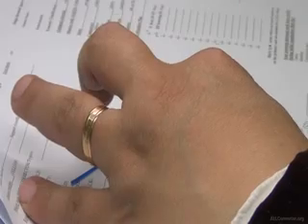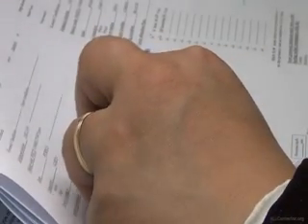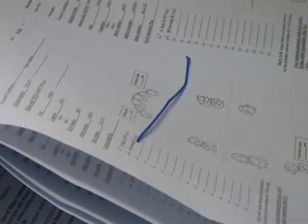If I'm talking about this fulcrum line, I have a rest here and I have a rest here to prevent rotation. If I'm talking about this fulcrum line, these are not principal fulcrum lines. The principal fulcrum line is this one, the last one. But these are fulcrum lines running through the rest. These 2 posterior are preventing them. This is the principal fulcrum line. These anterior rests are preventing the rotation there. Okay? This is called quadrilateral support. 4 rests are present on both sides, 2 on each side. Here, I don't need to add components for indirect retention.